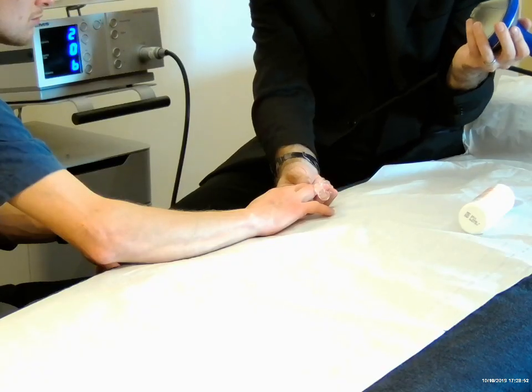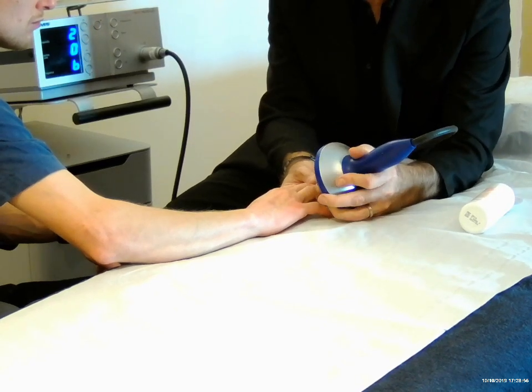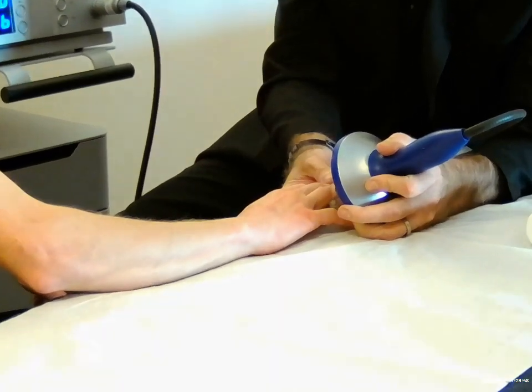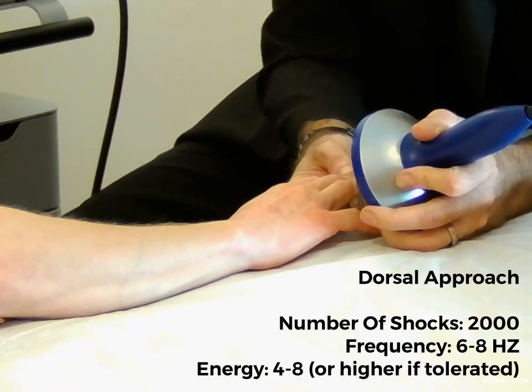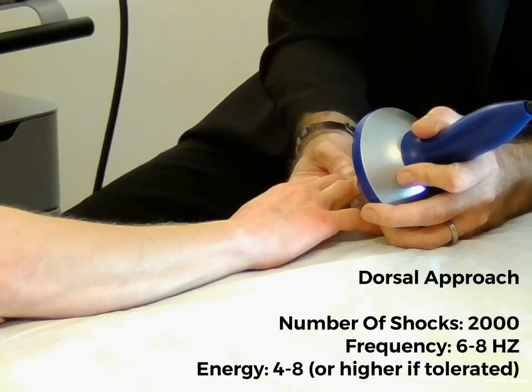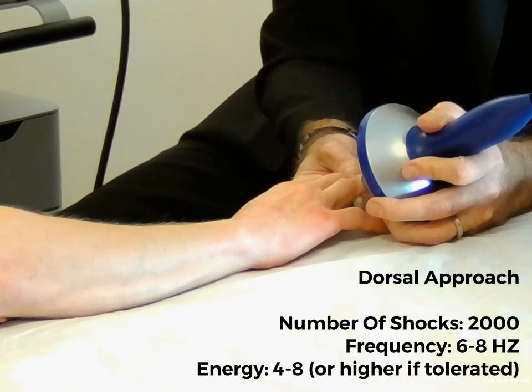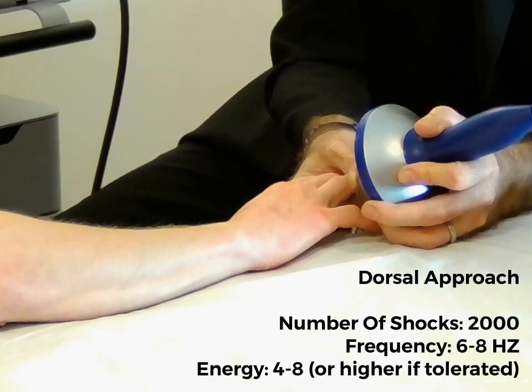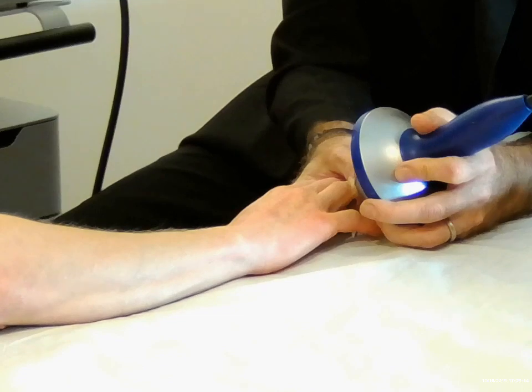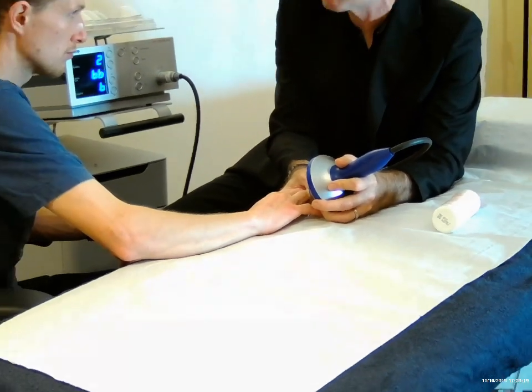So we've got the 5 millimeter head attached, so I'm going to apply it to the area of the actual injury, and that's been confirmed by palpation as well as sonography, but we're also going to get lots of patient feedback. The intensity is at 2 there, so we're just going to start the treatment. And keep in mind this is the 4th treatment, so the patient is going to tolerate a lot more than on day 1. Day 1, my records show that we got up to 3 maximum.